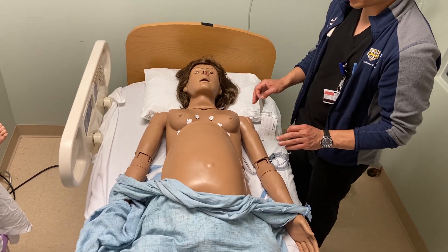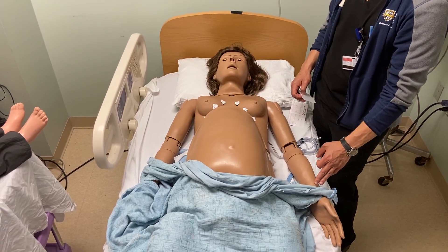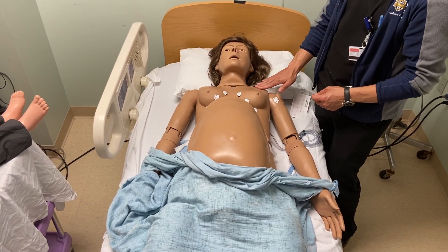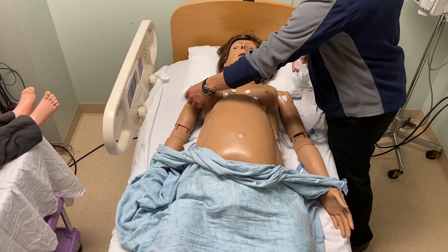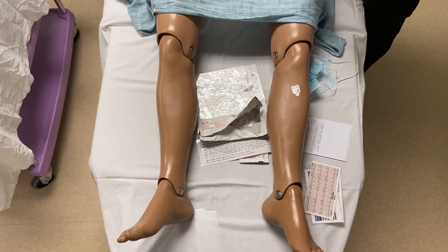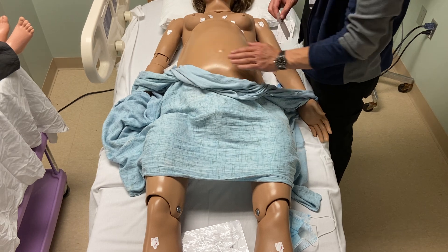And finally, our limb leads. In an otherwise compliant patient who's able to sit still, you can always put the limb leads anywhere between the wrist and the shoulder. If they're not able to sit still, you can put the leads just a couple of inches below the clavicle to keep them more stationary. Similarly with the legs, if they're able to keep their legs straight, you can put the leads below the knee, above the ankle, on either side. Otherwise, you can put them in the lower abdominal and pelvic area on the left and right side.